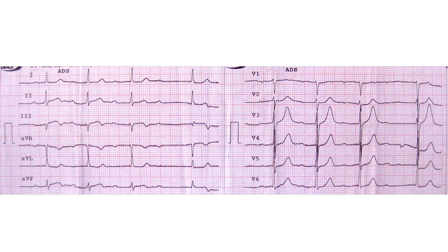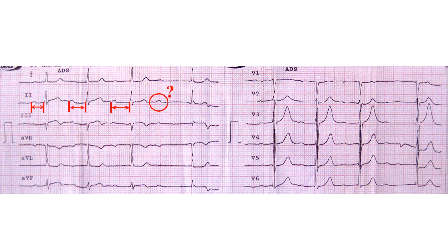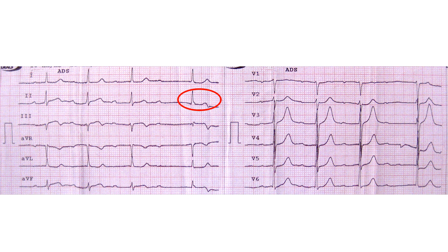We see ST segment elevation in leads 2, 3, and AVF. Also, the PR intervals before the first three QRS complexes are prolonged. The first PR interval is shorter than the second and third. The P wave after the third QRS complex appears to be non-conducted, and the fourth QRS complex is an escape beat.